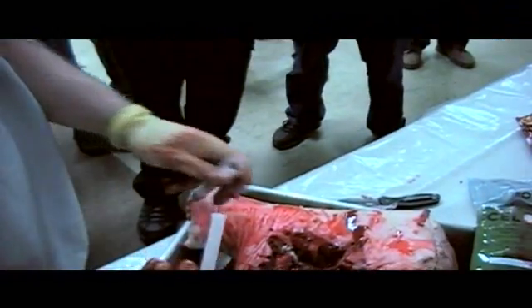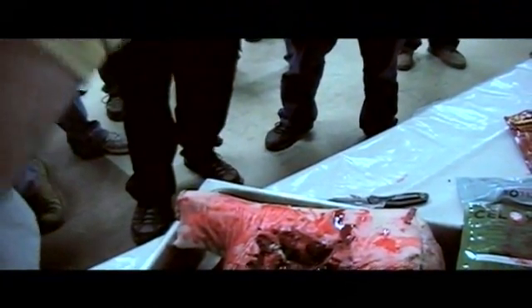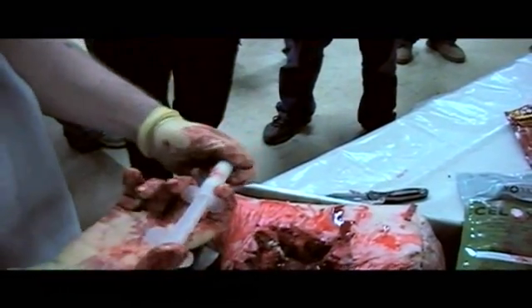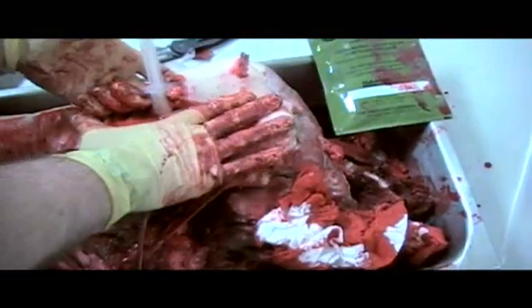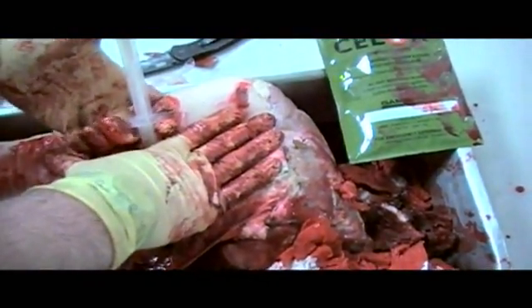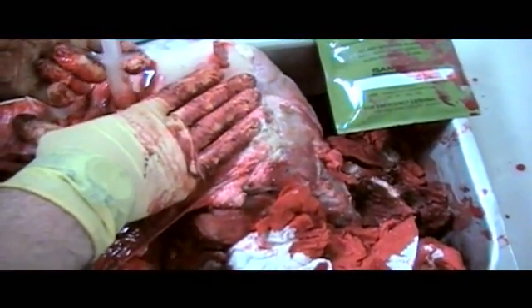The Celox-A — there's nothing to it. You don't have to screw it in. It's not like D50 where you have to screw the plunger down into it. You just pop that end off, insert it in here, take the end out, isolate the wound, and cram it down until he swings on you. Then, as we're applying direct pressure so we don't get kicked in the jaw, you're going to push this down and then draw the syringe back out.